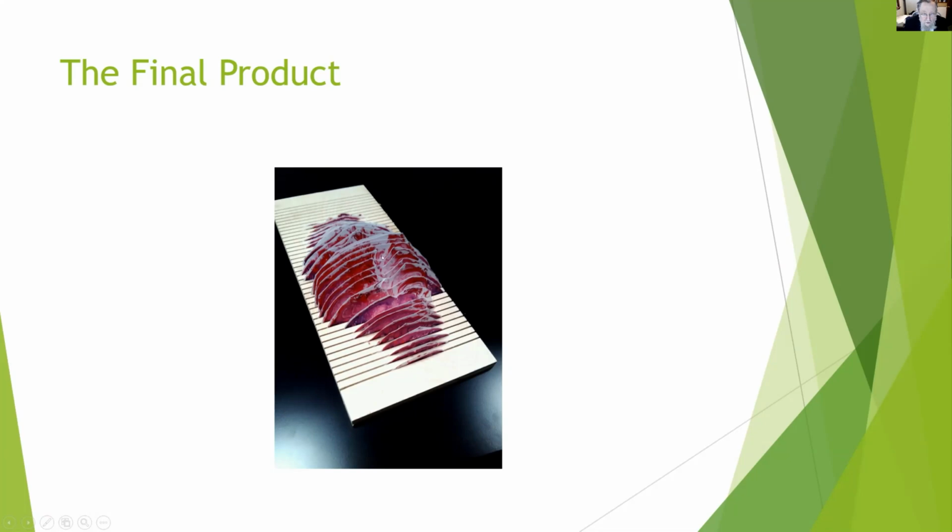You can pick out any one of these. Note that this is a real slide. You have all the details, all the colors, all the shading of a real slide. You want to see if it goes to the edge. You want to see if it goes down to subcutaneous tissue. You can take a look at it here, and as I suggested, see what's in front of it, see what's behind it, see all of these slides to see whether your particular section is representative.